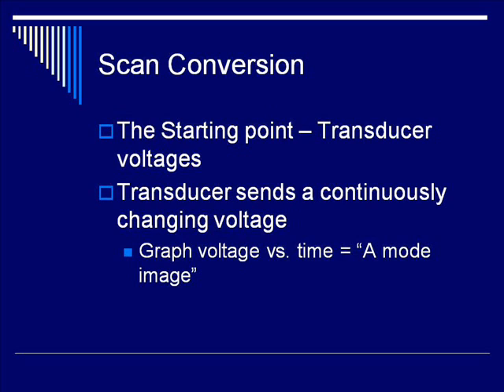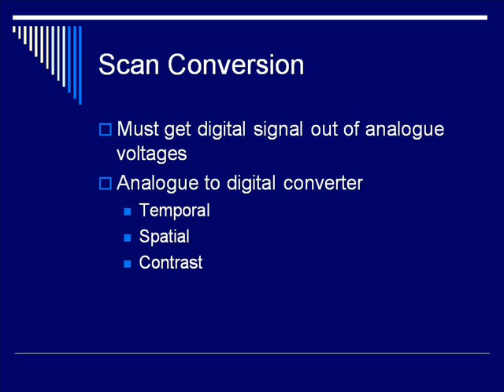And what that means is we need to get a digital signal out of analog voltages. And the part of the scan converter that does this is called an analog to digital converter.